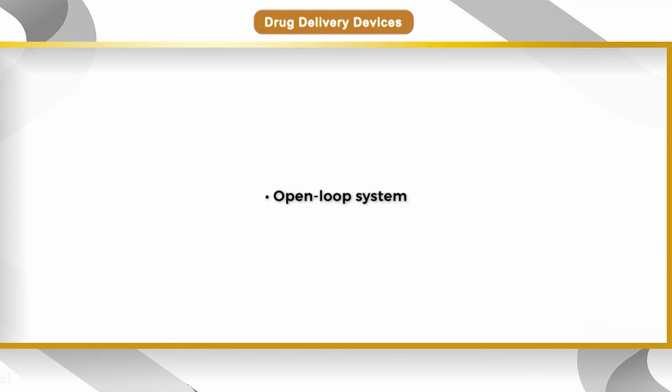Operating modes are available in different types. Open loop and closed loop systems are used for measuring the inputs, outputs and feedback, and control algorithm infusion rates. All these things are measured in this drug delivery system. Ambulatory and implantable infusion systems. Miniature insulin pumps are mostly open loop, lacking an implantable glucose sensor. In this condition, these miniature insulin pumps are used.